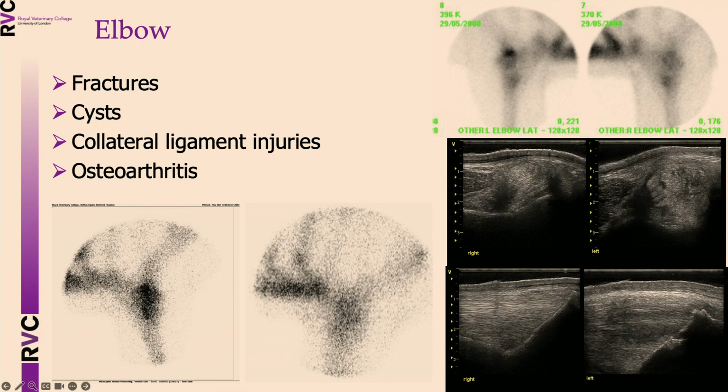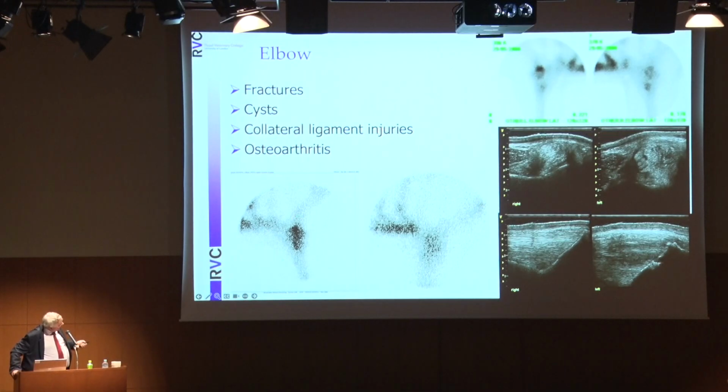And this can progress to osteoarthritis, which may also be picked up scintigraphically.